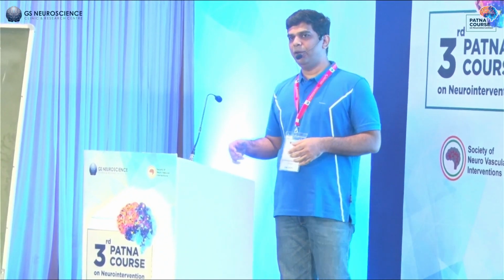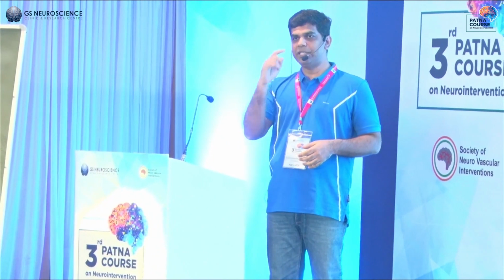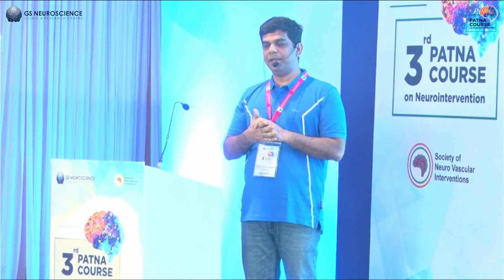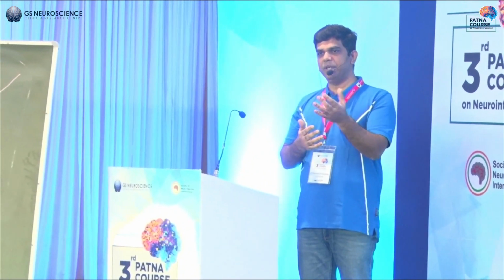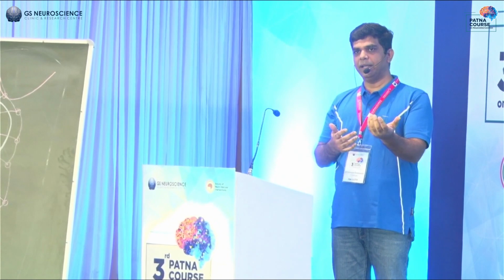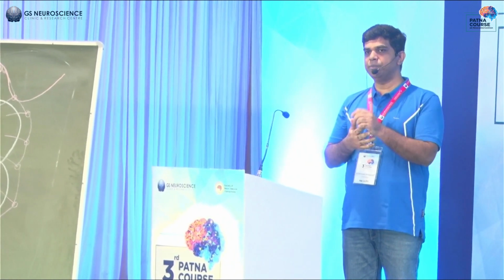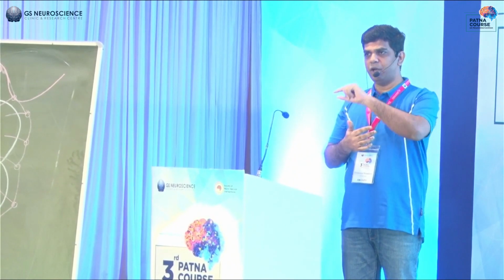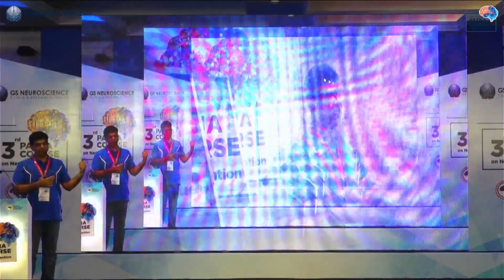You have to understand the anatomy, how the loop is, with the AP and lateral views, and if possible, take a 3D and then understand the anatomy. And catheterization with the Magic 1.2 comes with experience. The Magic 1.2 comes in 2 configurations, one is FM and the other one is F. F has a long, supple segment, whereas FM has a short, supple segment. And the FM is the one that will work here in most situations.